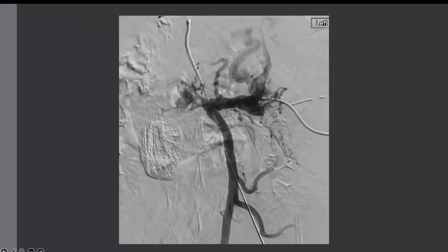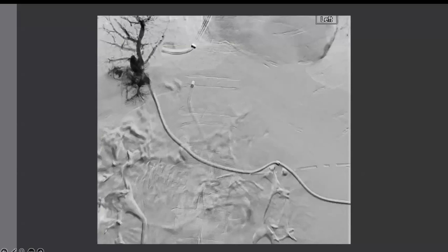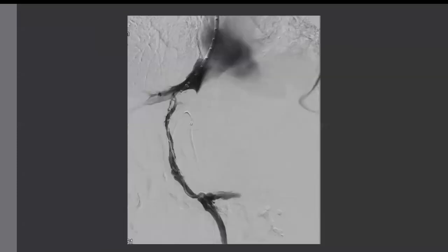You inject, and you see these little spidery veins. It's not that big globule like we saw in the last one. It's these little guys. And so ultimately, you give yourself some sort of target. This is important here. You can see in the top left of the image, these are normal looking intrahepatic portal veins. These highest ones, these branches up top. And that's good. That means that you're in the right place and you know that there's still some native portal flow inside the liver, which is going to be important for this.